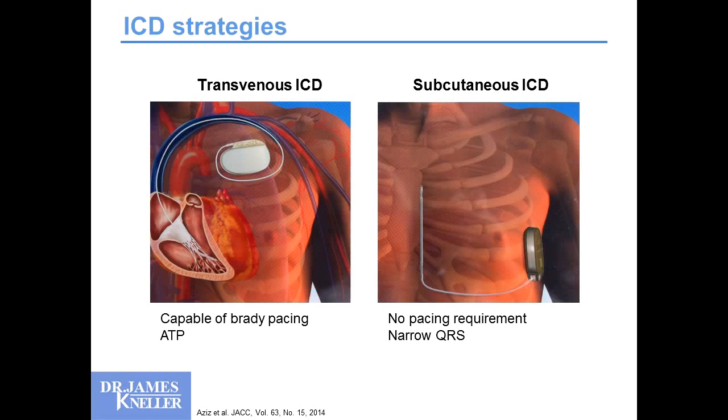And more recently, we have the Boston Scientific product, which is the subcutaneous ICD. The whole thing sits outside your thorax, so the ICD is sitting under the skin on your side, posterior enough that if you place an ICD lead under your skin and up the front, you'll sandwich enough myocardium that that system can shock you into normal rhythm. And that device does work extremely well, and the discriminators for SVT or inappropriate rhythms also work exceedingly well.